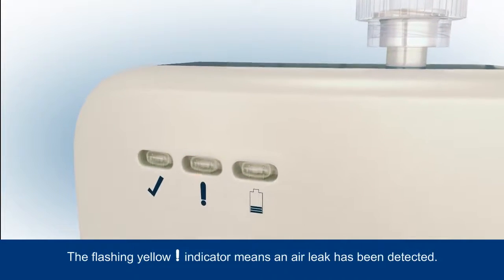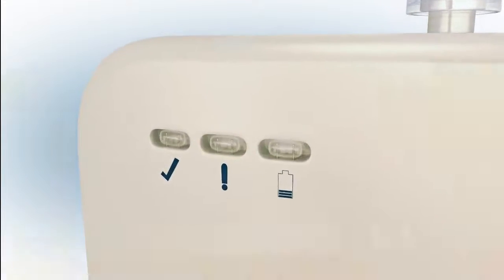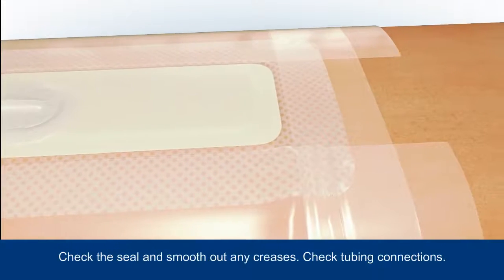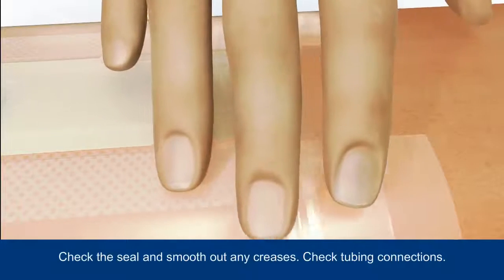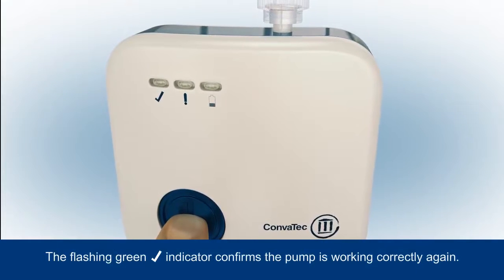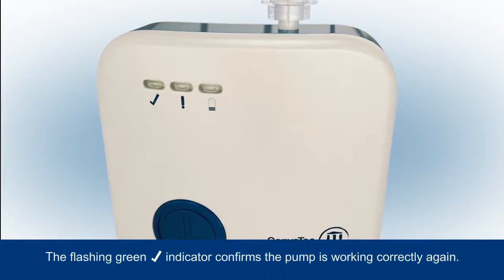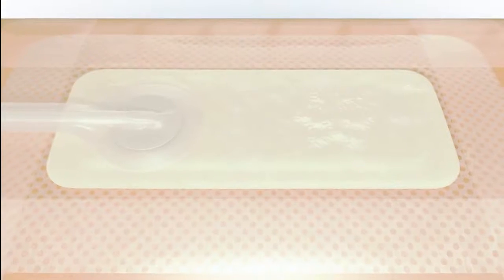If an air leak is detected, this will be indicated by the flashing yellow warning indicator. Ensure you check the dressing seal and smooth out any creases, and check the tubing connections are secure. Press the blue button for 3 seconds to resume therapy — the green tick indicator will then begin to flash as therapy is successfully restarted.